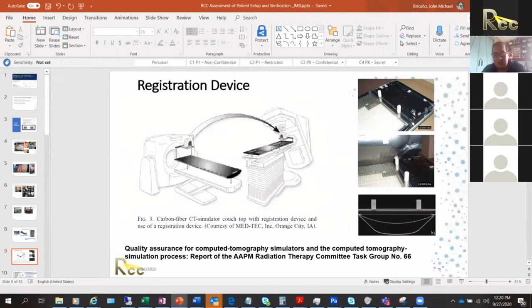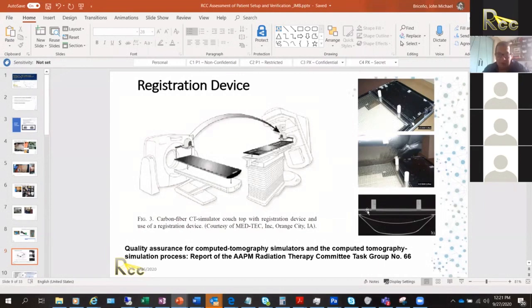For example, on a Varian couch, there is an indexed immobilization device — an index bar with two rods. These rods help immobilize the alpha cradle or immobilization bag. You can see the device's position on the CT simulator so you have a better idea of your patient's position.